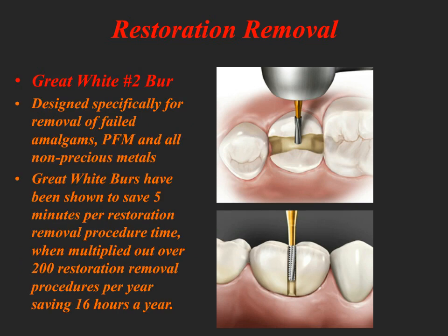The Great White Burr is a cross-cut fissure burr designed specifically for the removal of failed amalgams, PFMs, and all non-precious metals. Great White Burrs have been shown to save 5 minutes or more in restoration removal time because they cut through metallic materials efficiently and quickly.